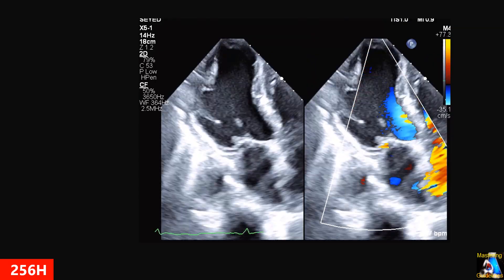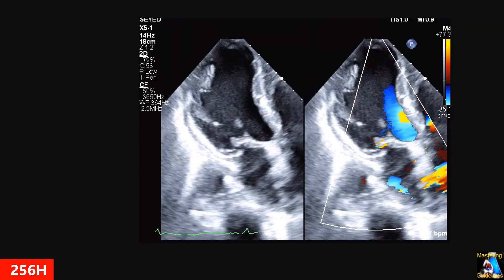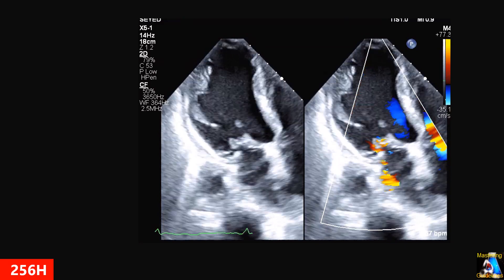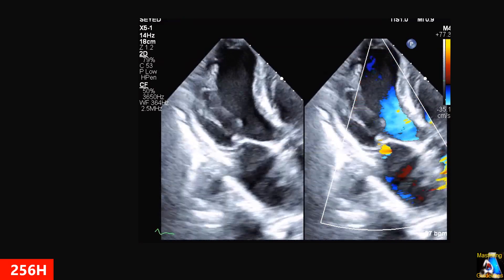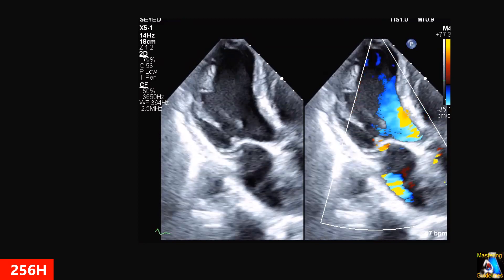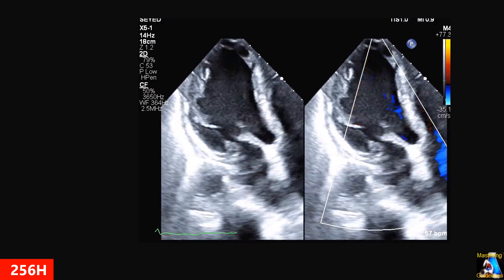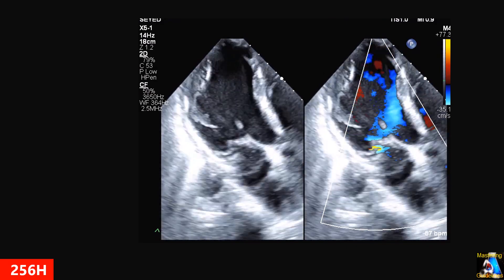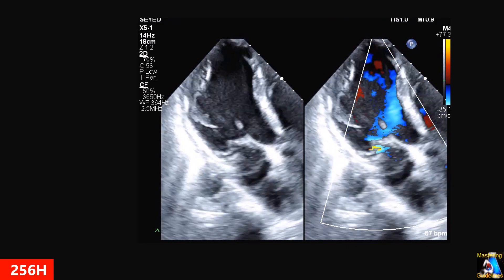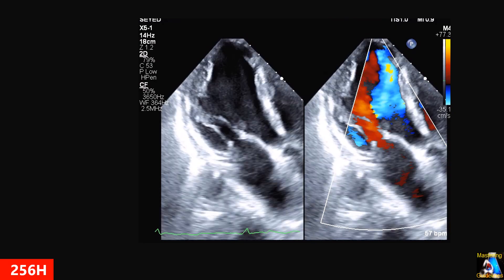Here is another one. What is wrong with the setup, or what are the differences? Is it normal or not? What do we use in this view and why do we use it? Is that correct or not, and what do we have to do?